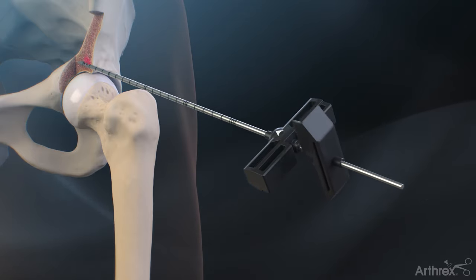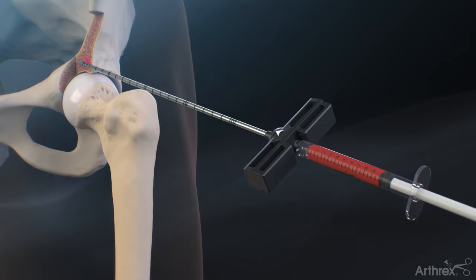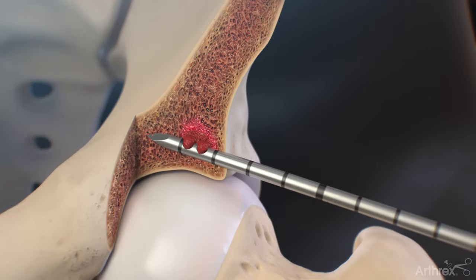Remove the inner stylet to complete the core decompression and deliver the BMA and AlloSync Pure mixture directly into the lesion.